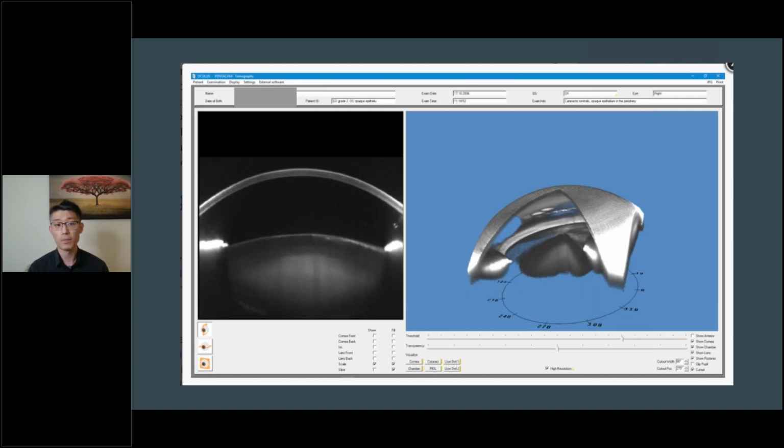This is our eye from the cornea to the lens, which helps us appreciate how the axial length evolves over time. Sometimes I can even demonstrate to the patient that your eye is physically getting longer, so physiologically it's not really healthy to have a football shape in your eye.